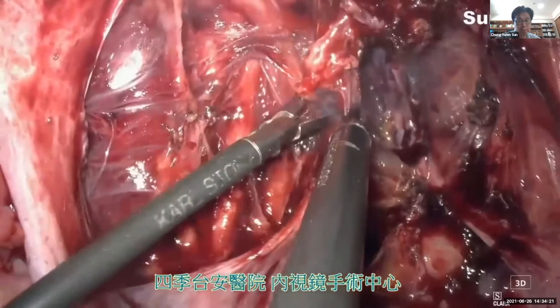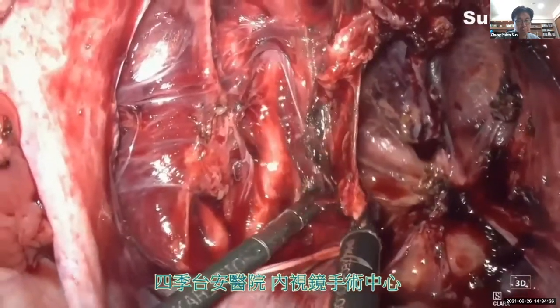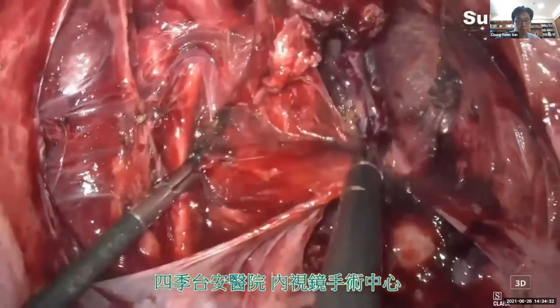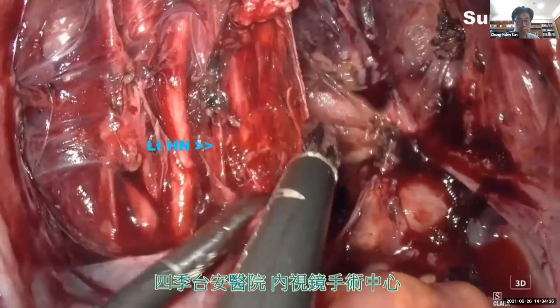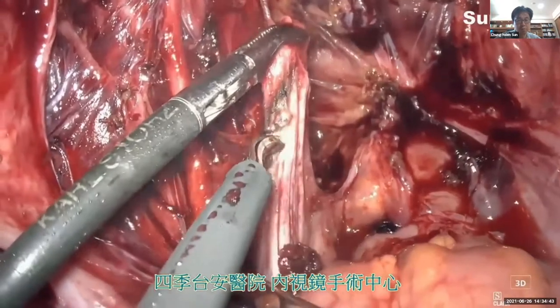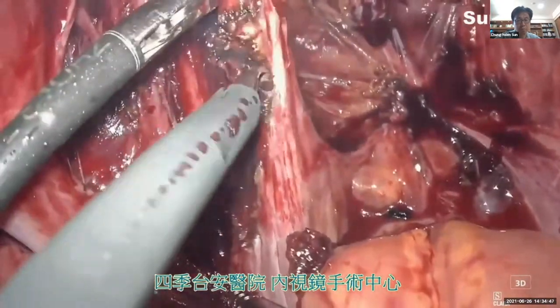Now, in this area, we have to take care not to injure the hypogastric nerve. So we are now trying to separate the hypogastric nerve away from the uterosacral ligament. Okay, now we are removing the endometriosis lesions over the left uterosacral ligament.